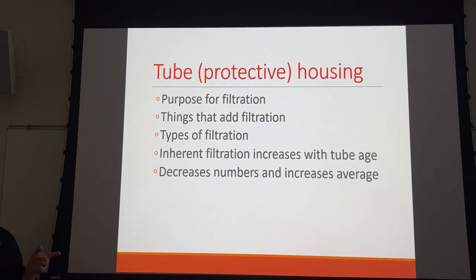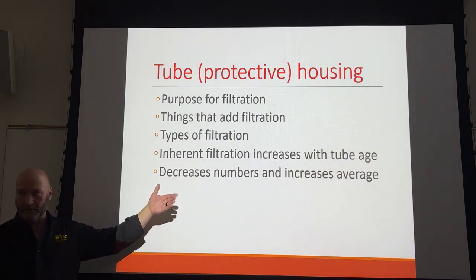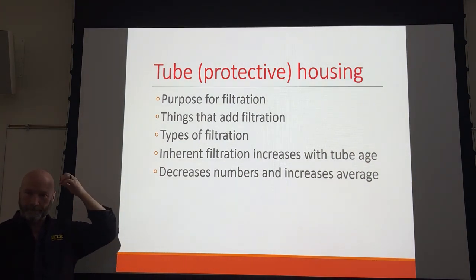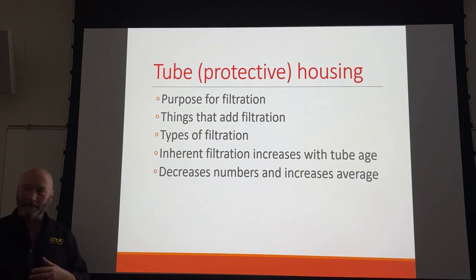With filtration, you're going to get an increase in average, but you're going to get a decrease in numbers. Okay, so that's where you're going to have a tendency to trip up. You're going to look at filtration and say, well, I got a better filtered beam, so I got a higher average. I got a better quality beam with increase in KVP and increase in generator type. Then naturally, I'm going to have an increase with filtration. What you're left with is more penetrating x-ray beams, but you're going to lose so many numbers that you're going to lose exposure. Okay, so don't make that leap.